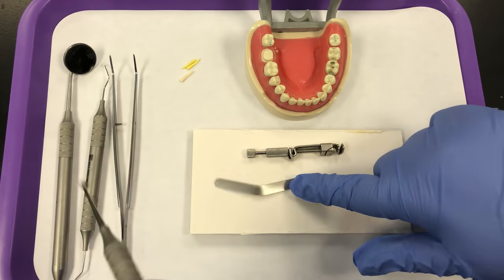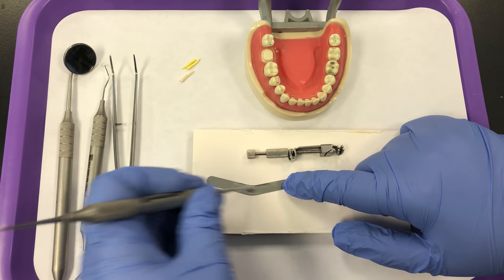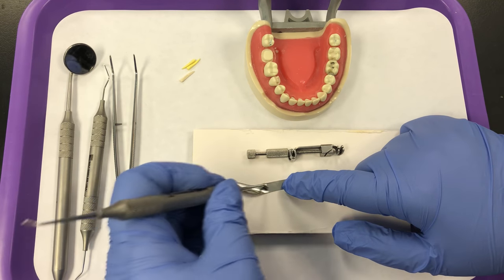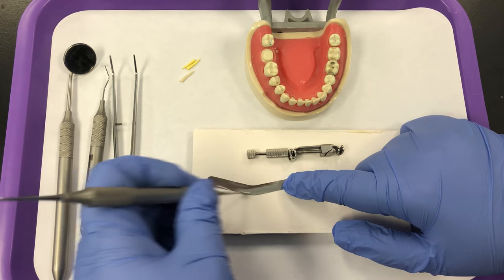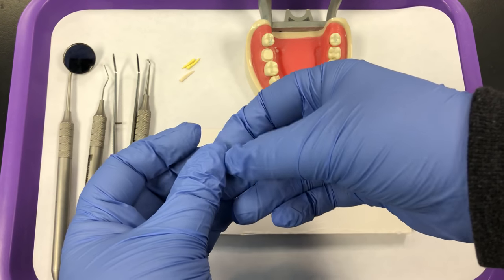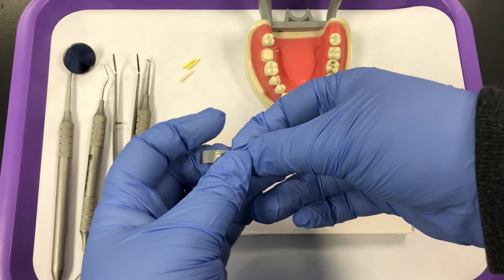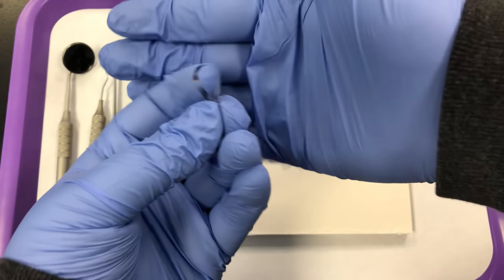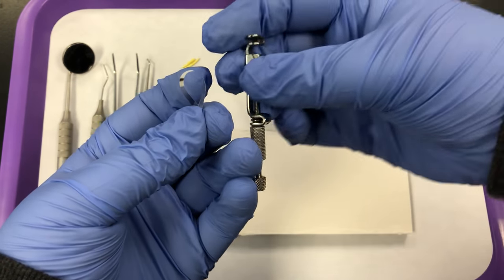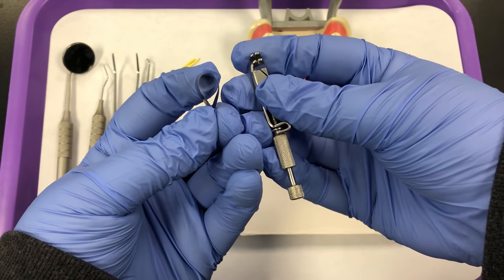I'm going to start by burnishing the band, which will help contour it and create a slight bend. You don't want to burnish too much — just a slight bend — and you'll see it become shiny where you burnish. You only really have to burnish that middle section. Bring the tail ends together, starting with the smile shape. The gingival side is on top; you always want to assemble it by looking at the gingival side. Always hold your retainer with the gingival side facing you.